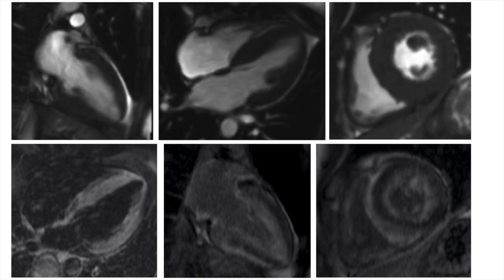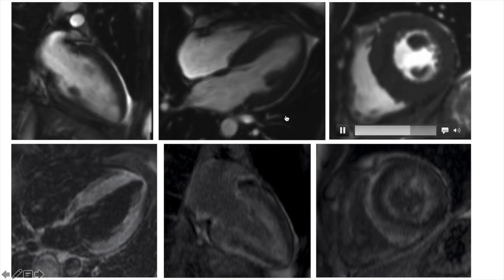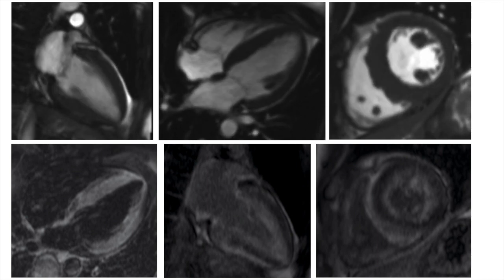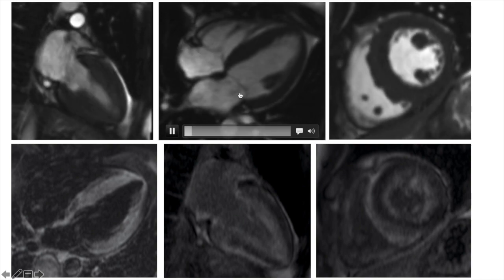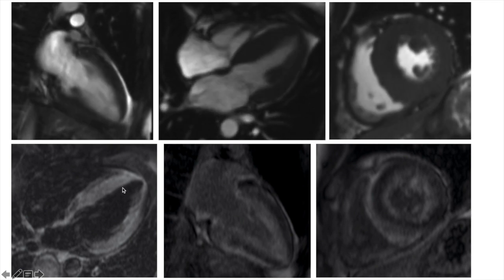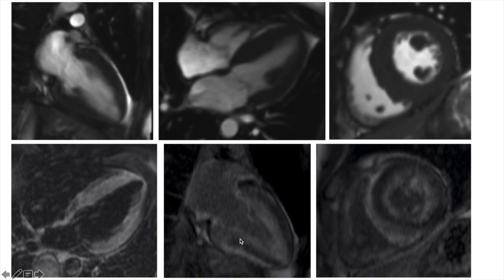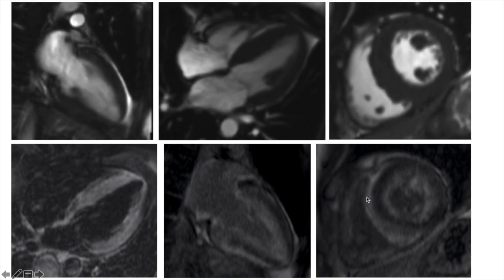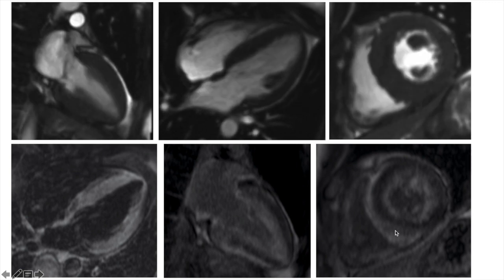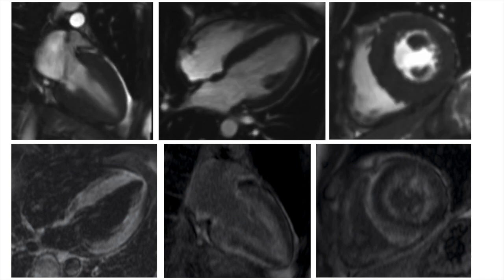This is another patient with similar concentric LVH but preserved systolic function. The top row shows concentric LV hypertrophy, mild interatrial septal thickening, and mild to moderate mitral regurgitation. The bottom left STIR image shows diffuse myocardial hyperintensity. The 2-chamber and short axis late gadolinium enhancement images show diffuse subendocardial delayed enhancement in the LV with enhancement along the RV side of the septum. To conclude, cardiac MR is very specific in the identification and diagnosis of cardiac amyloidosis.